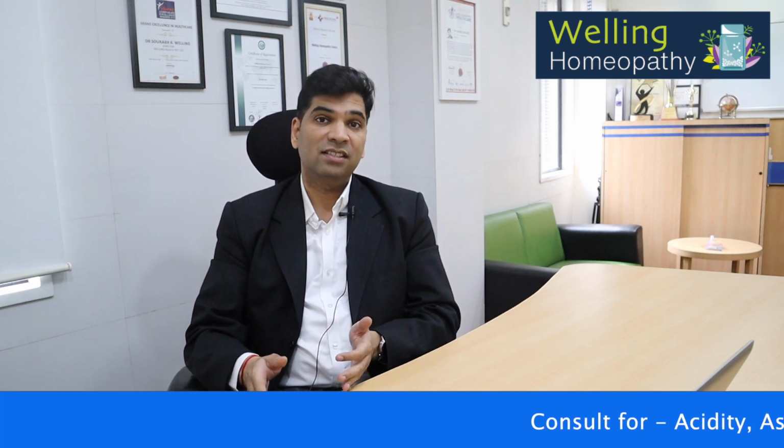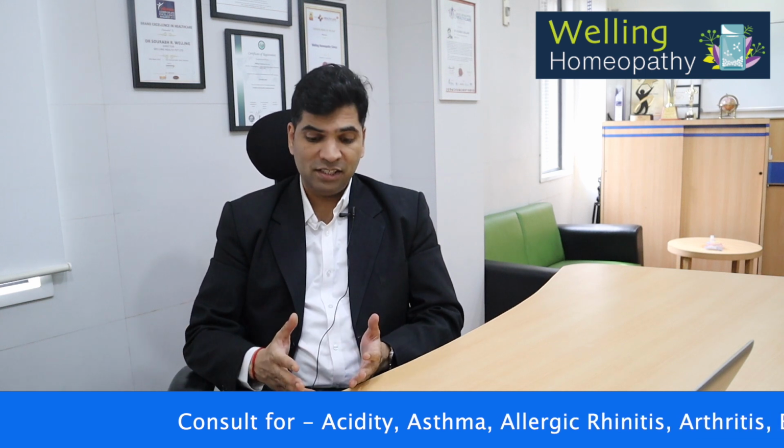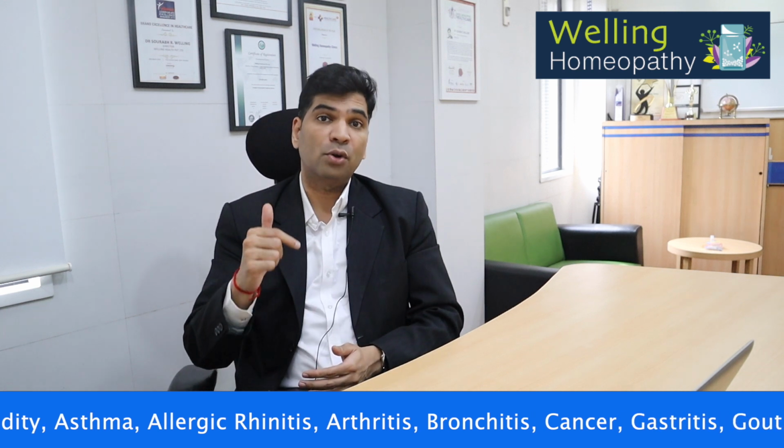Using ovulation strips can help you time your sex for pregnancy. Ideally, when you get a positive result on the test, you should have sex every day for the next few days. But the chances of pregnancy are highest when sperm are already present in the fallopian tubes at the time of ovulation. So what to do?